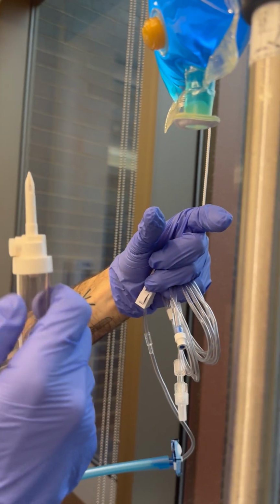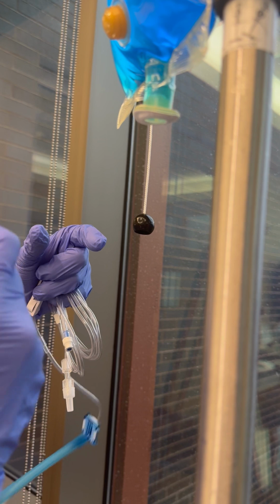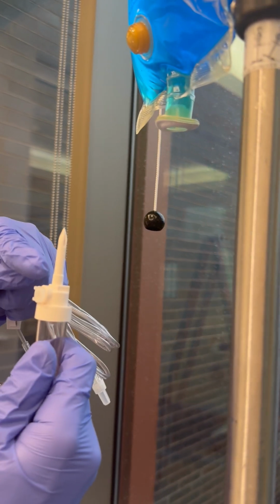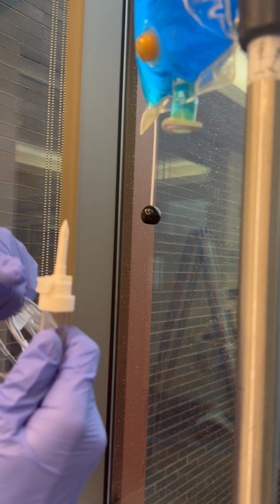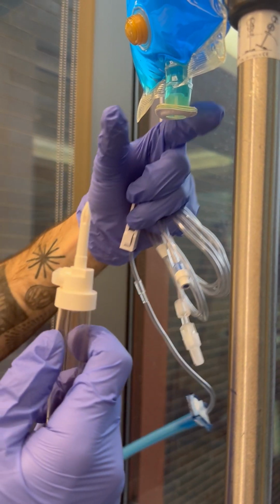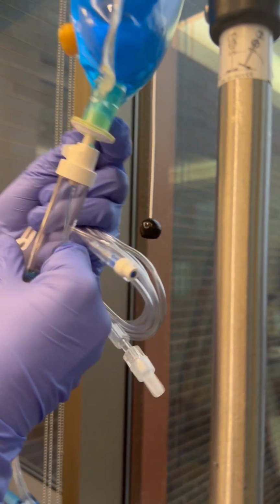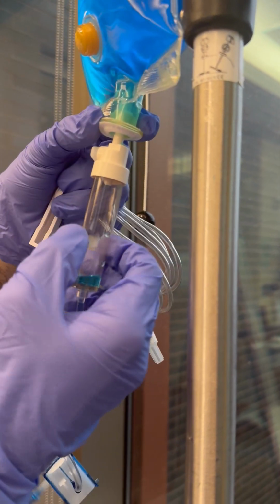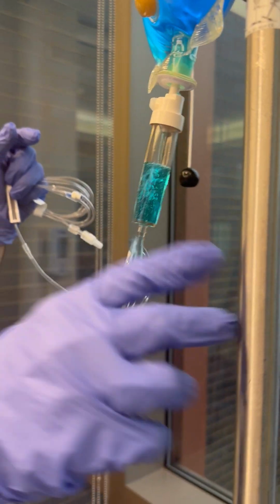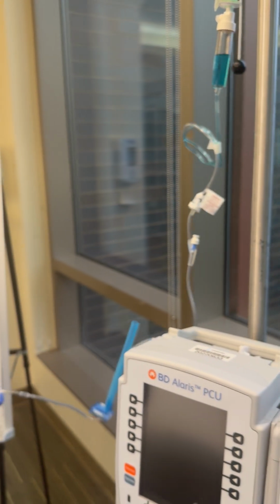When you go and spike it in, you want to kind of do it with force, and then also twist until it gets all the way down to that little, what would you call that? Like that little hub thing there. So we'll just go ahead and do it with force. Feeling, oh, whoops. That was the other thing. Shoot, I was talking, I was distracted. So that's what you don't want to do. We were literally talking about this earlier today.